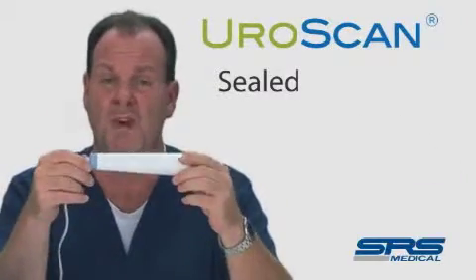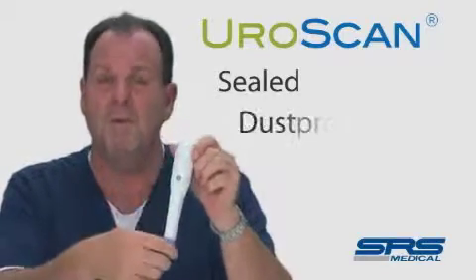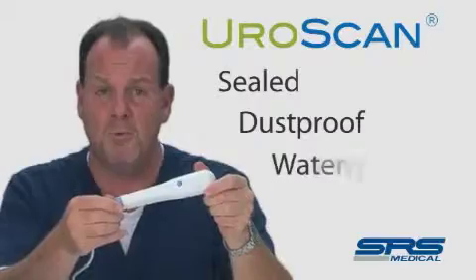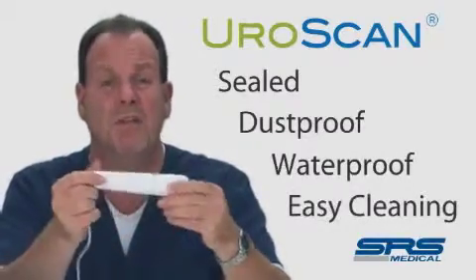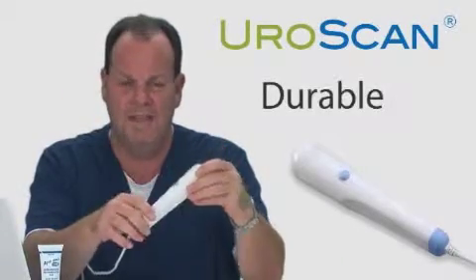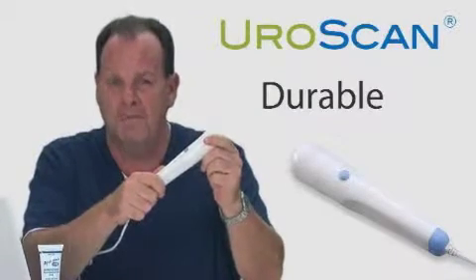It's a sealed device with all the electronics built into the probe. Because it's sealed, you don't have to worry about dust getting into and fouling the instrument. It's waterproof — it can be submerged and cleaned with alcohol wipes, Cidex, or any other cleaning materials you have on site. This device is made out of hard plastic and can handle the rigors of everyday use in both the hospital and office environment.